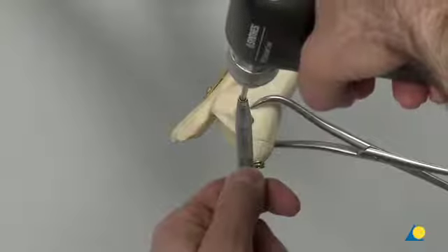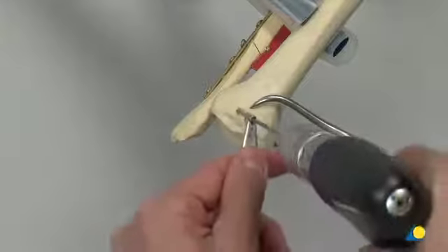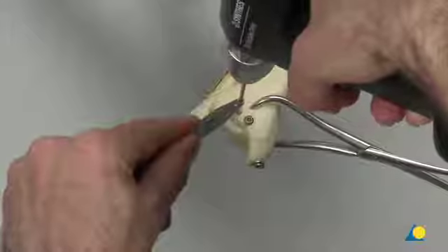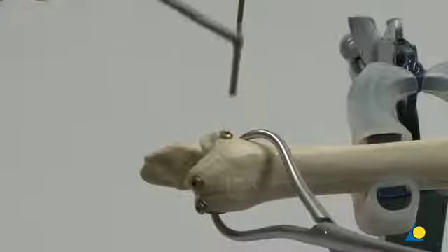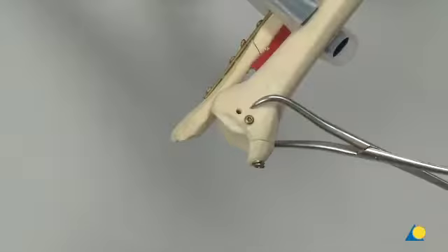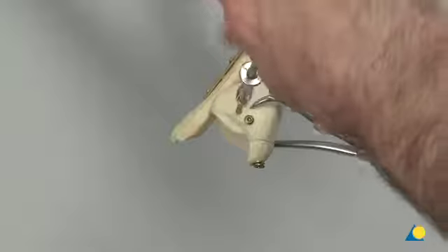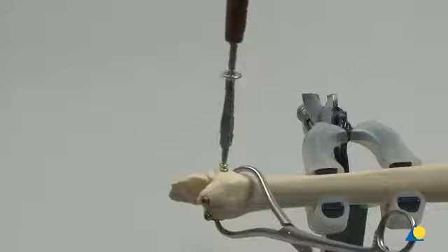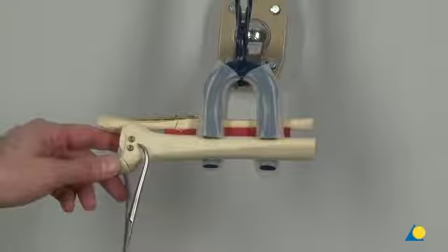If necessary, a second 3.5 mm self-tapping cortical lag screw can be inserted parallel to the first to protect the fragment from rotation. The reduction forceps is removed.